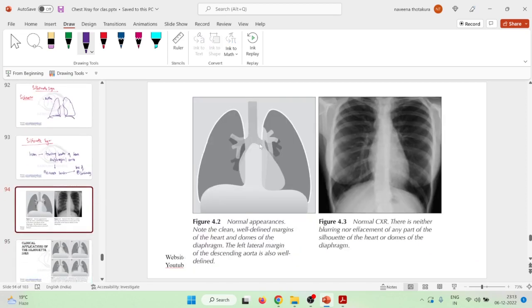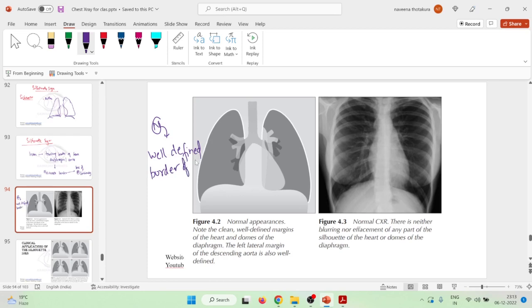On a normal chest X-ray, you will see well-defined borders of the heart and also the diaphragm. The heart and diaphragm borders are clearly and easily well-defined.